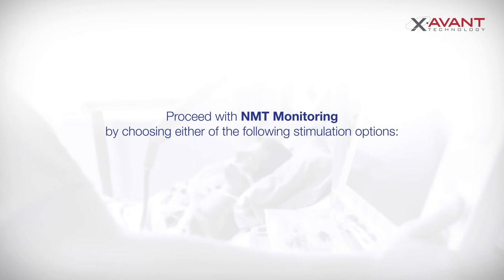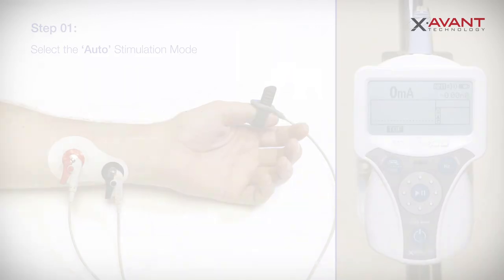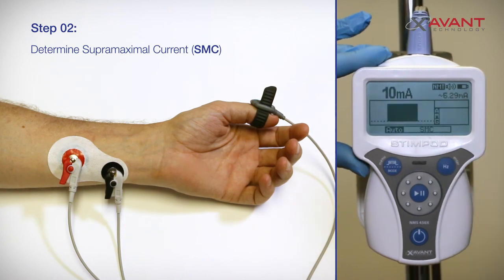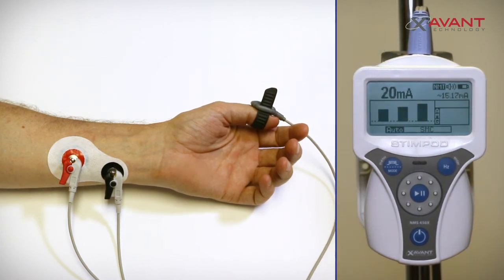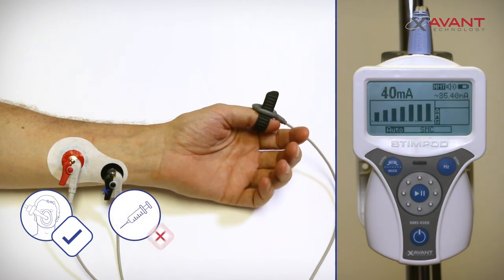You can now proceed with NMT monitoring by choosing either of the following stimulation options. Option A: Auto Mode. Use the Mode button to change the stimulation mode to Auto Mode. Press the Enter key to initiate the supermaximal current. It is very important to make sure that your patient is anesthetized at this point, but not relaxed yet.